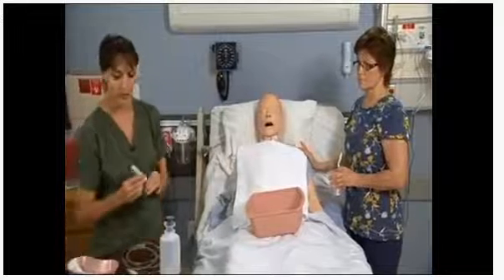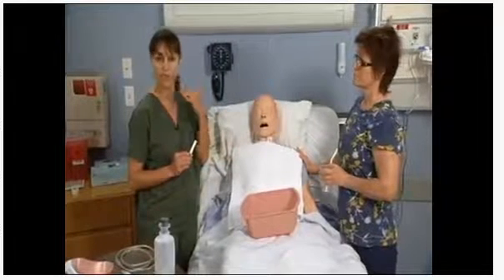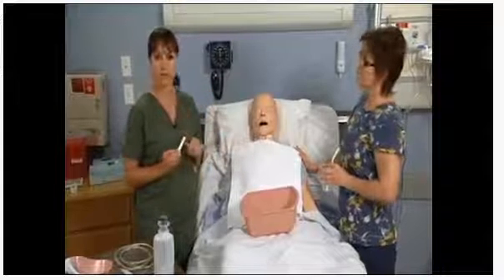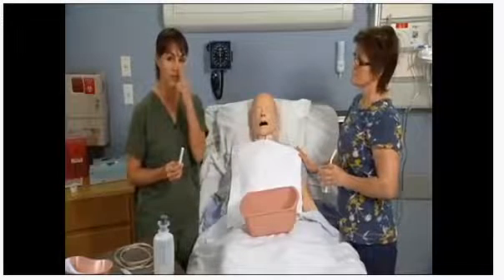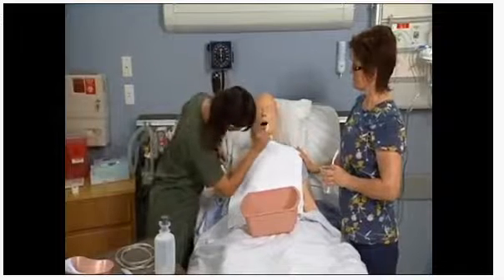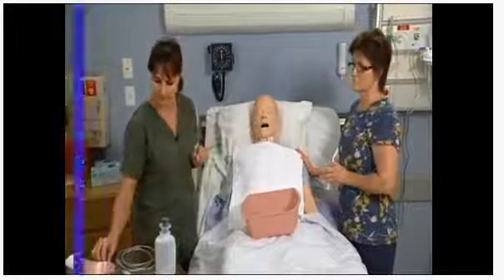At this time, if you needed to, you could still, like before, ask the patient if they had any kind of deviated septum, nasal surgery, had a broken nose in the past. If none of that has happened to the patient, you can also ask your patient to close one nostril and breathe out and do the same on the other side. And that way you can see which nostril is going to be the most patent. Also take a look inside. The right side looks pretty patent to me, so that's the side that I'm going to go on.